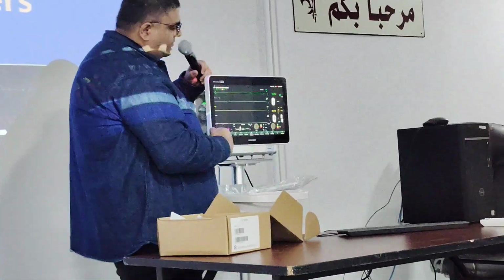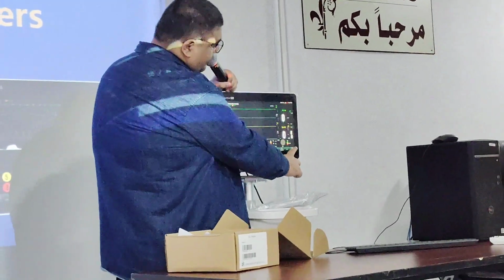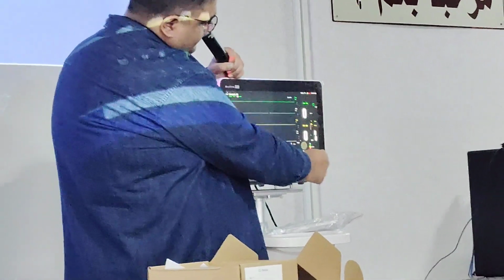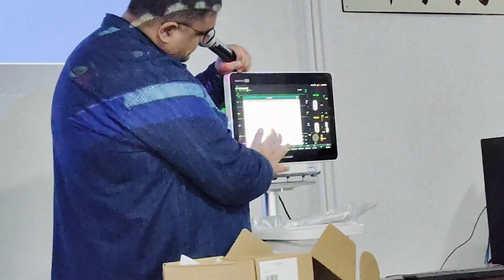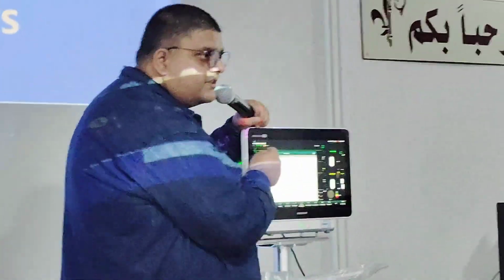No? Okay. So there are 2 ways. There is the harder way, and then there's the easy way. So let's go the harder way first. Here we have a main menu. It's always over there. So we can go over here, and you see there are a couple of columns. I can go over here and choose display.